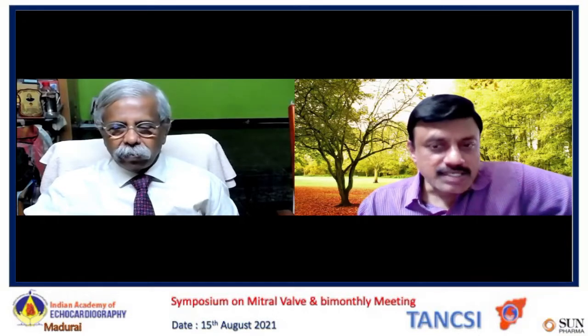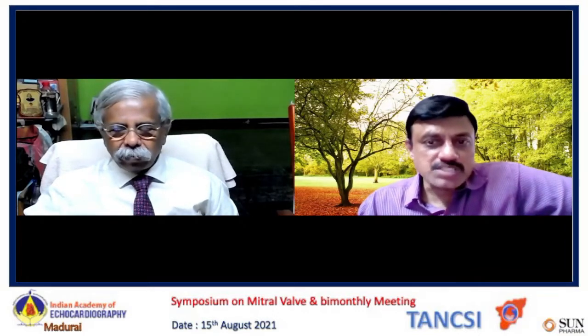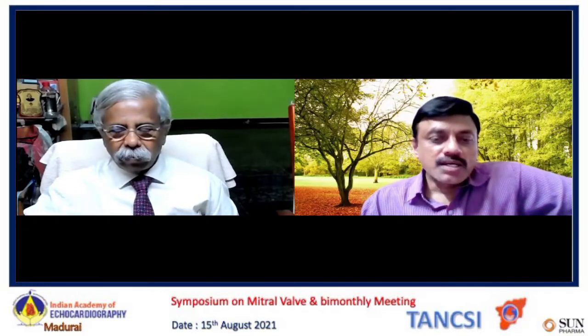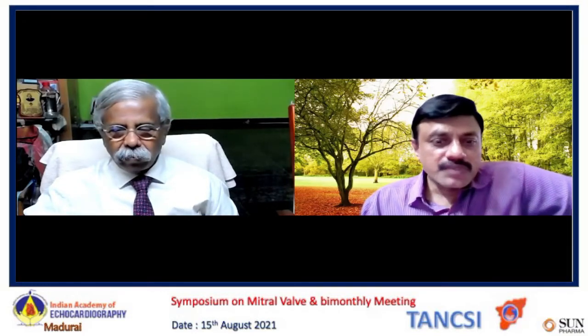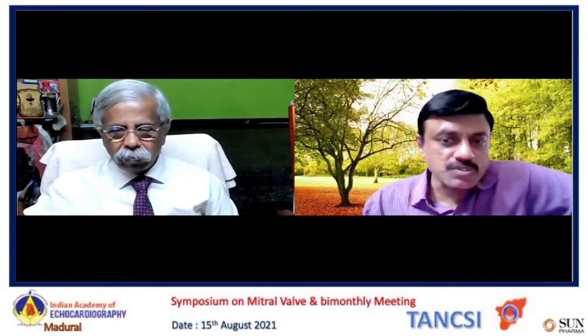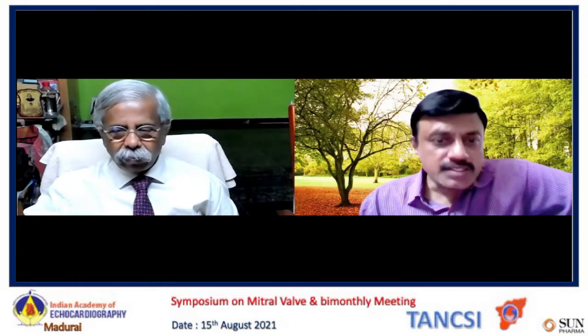And this second case was a prosthetic mitral valve which was stenosed, and he was sick. Obviously, in such cases, the first indication will be to do a redo MVR. But we were thinking of trying for interim relief with balloon mitral valvotomy. There are several reports that many times a prosthetic mitral valve can yield to a balloon.